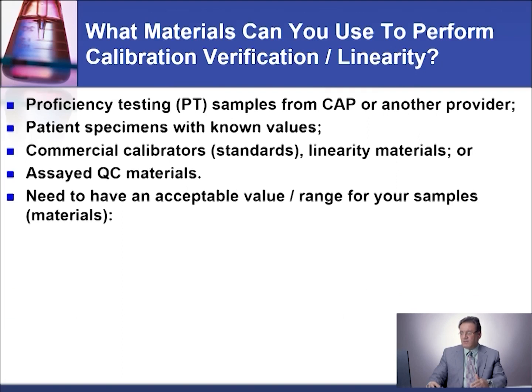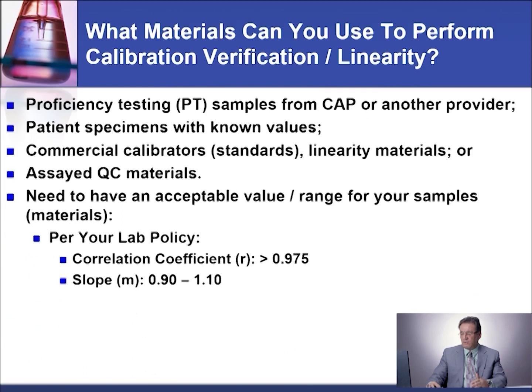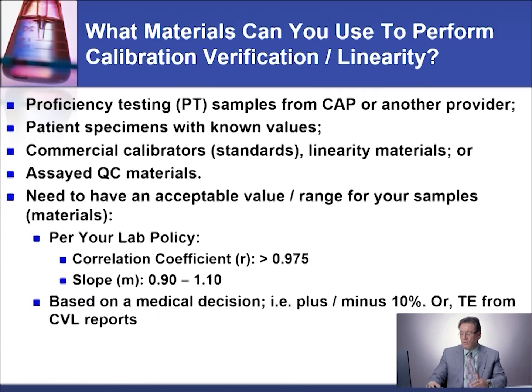You need to have an acceptable value and range for your sample and material. You can use something like this, or based on a medical decision, you can have your own acceptable criteria based on a medical decision.